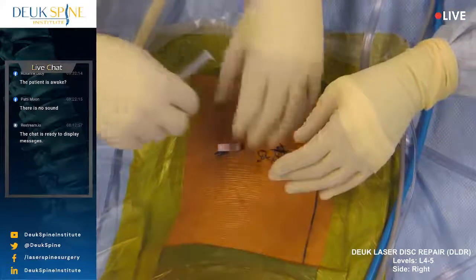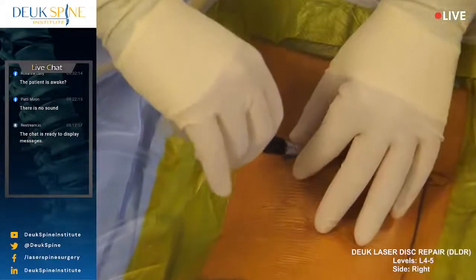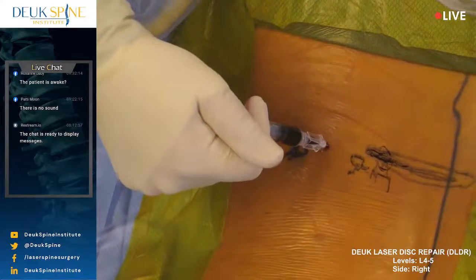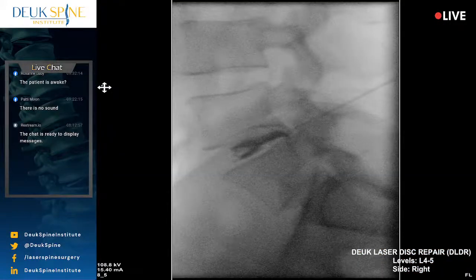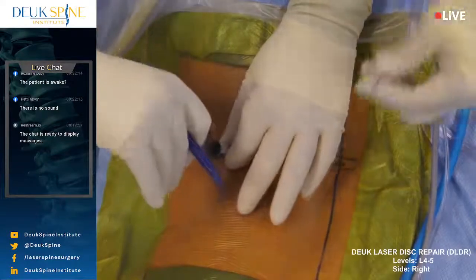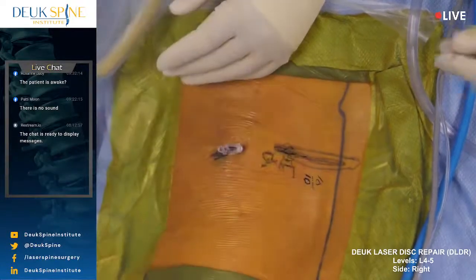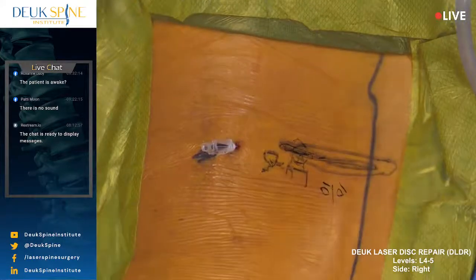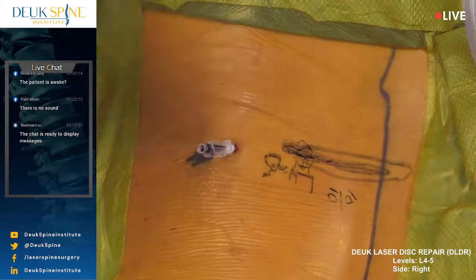All right. You comfy? How bad is that on a scale of 1 to 10? 10? Is that your typical back pain? Is that the location of your typical back pain, that area? But not that severity? Yeah, I understand. All right. Well, that's the bad disc that we're fixing today. So it was a 10 over 10. It is his typical area, just not that severe. Make sure that you don't do anything to bring on that much pain, I'm sure.